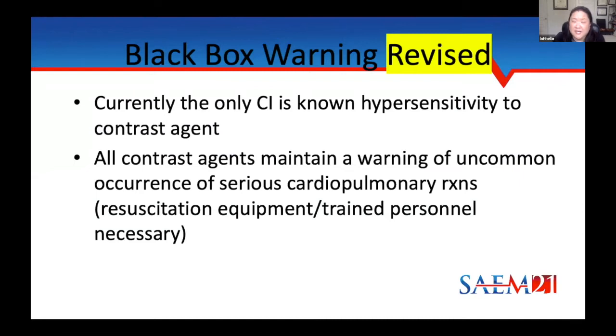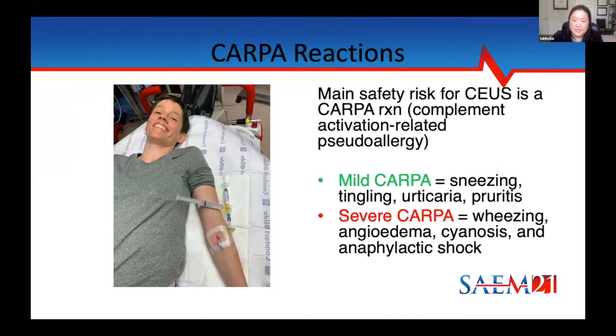Currently the only contraindication to getting these ultrasound contrast agents is a known hypersensitivity to them. All contrast agents continue to maintain a warning of occurrence of serious cardiopulmonary reactions. So when you're giving these agents, you should have resuscitation equipment and trained personnel nearby. The main safety risk is the CARPA reaction. Mild CARPA reactions consist of things like sneezing, tingling, urticaria, and pruritus. With more severe CARPA reactions, you'll see things like angioedema, cyanosis, and anaphylactic shock.